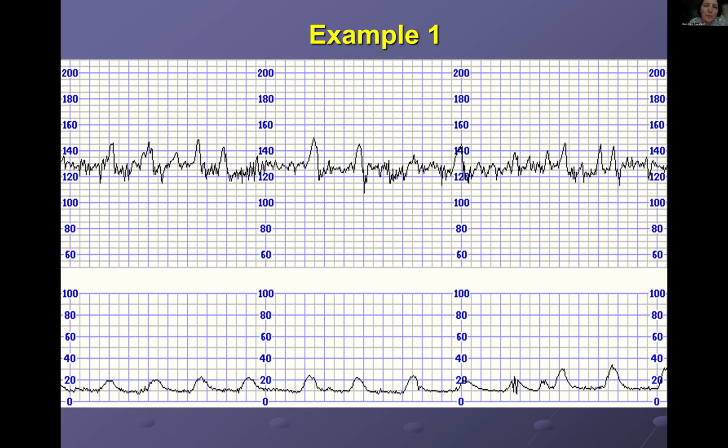And so your overall plan, what would you do after having seen this? This is a reassuring CTG. Yes, I agree with you. So I think we can go on with augmentation. I agree. Very good, Philip. Well done.